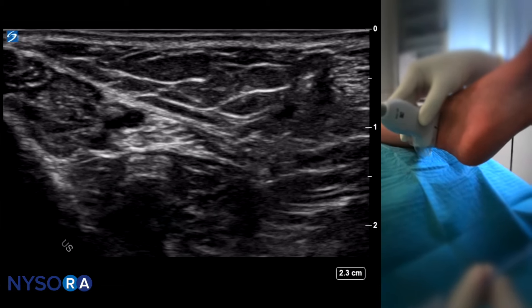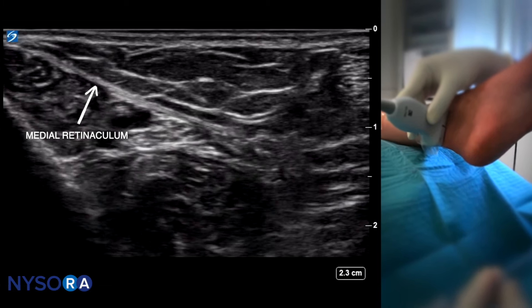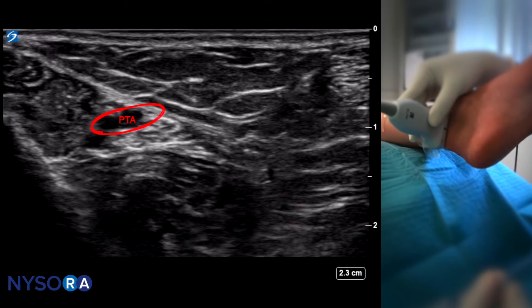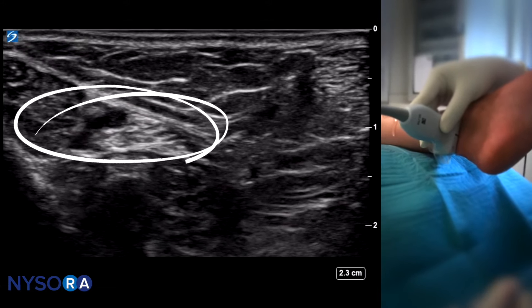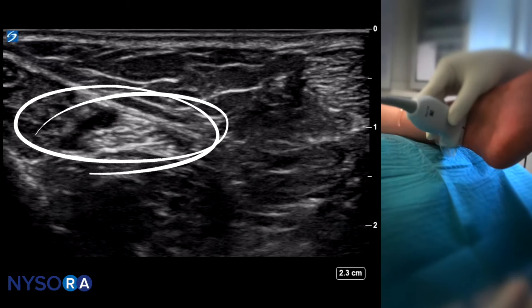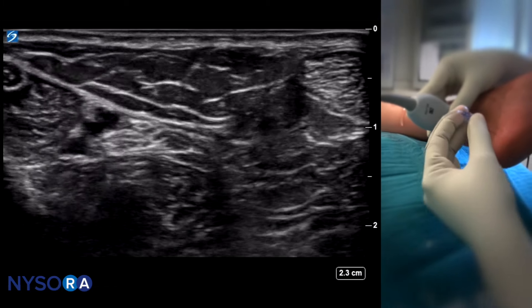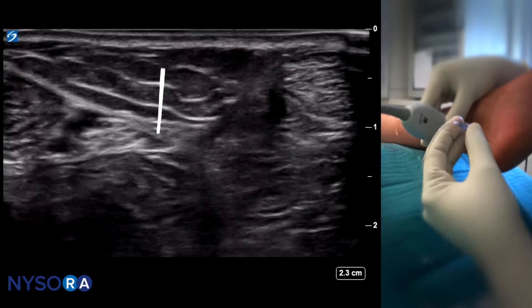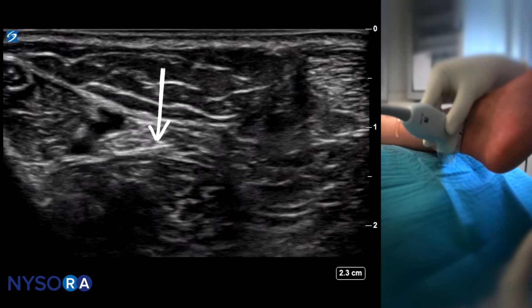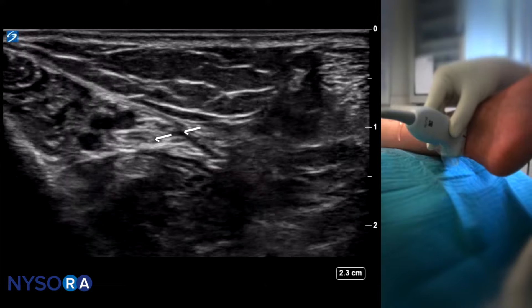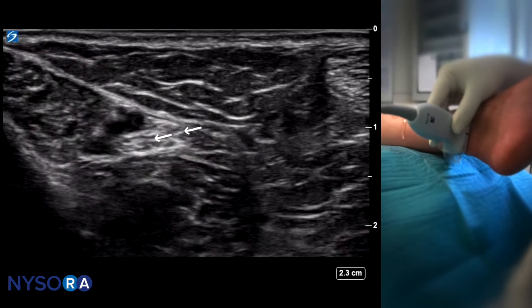On the ultrasound, we can see the medial malleolus, the medial retinaculum, the posterior tibial artery and veins, and in that compartment is the tibial nerve. What we aim to do is place the needle into that compartment. If the injection is successful, we would see the local anesthetic pushing the nerve away, indicating that we have injected into the space that contains the nerve.